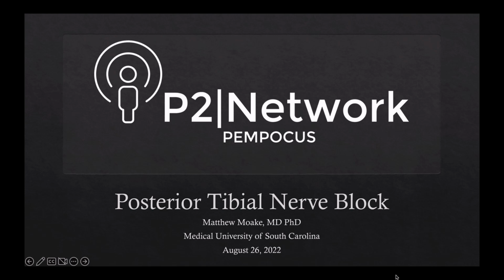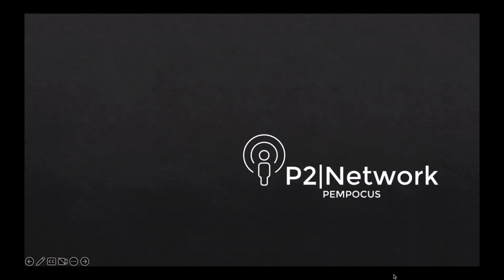My name is Matthew Moake, Assistant Professor of Pediatric Emergency Medicine and Director of Pediatric Emergency Ultrasound at the Medical University of South Carolina, and today we're going to talk about the posterior tibial nerve block.